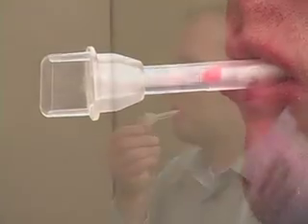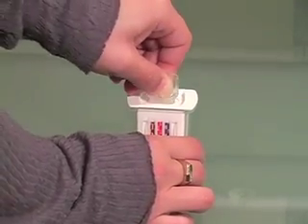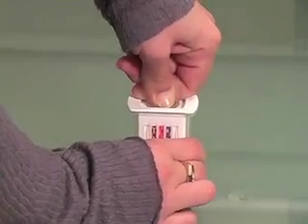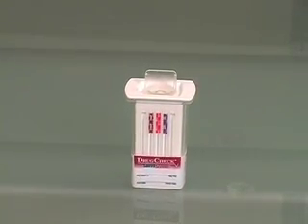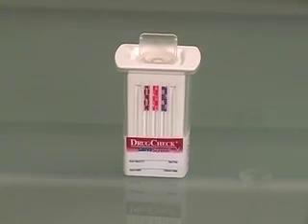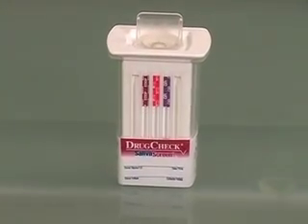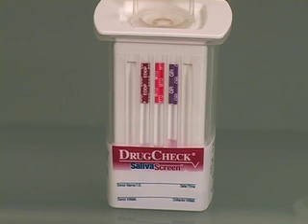Once the test administrator observes color on the saturation indicator, the donor hands the collection swab to the administrator, who then inserts the swab sponge-down into the screening device, pushing until the swab locks into place. The test begins to run as the test strips wick up the specimen.